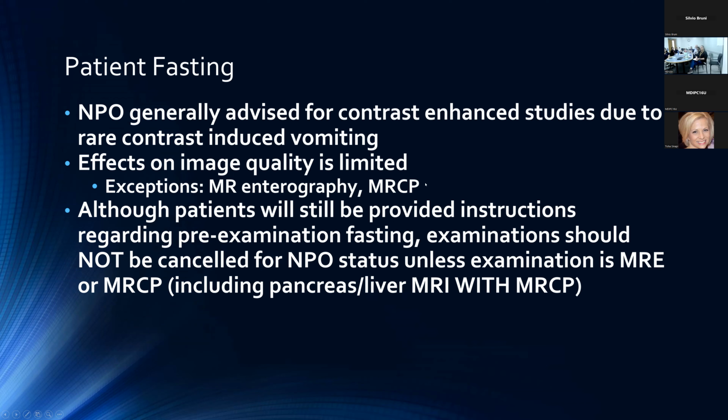So in those two cases, I would say that these patients should be canceled and rebooked if they're coming in and not NPO. Although obviously we're going to continue asking patients to be NPO and providing those instructions regarding pre-examination fasting, I would generally say that with these two exceptions, these cases should not be canceled just because the patient failed to be NPO.